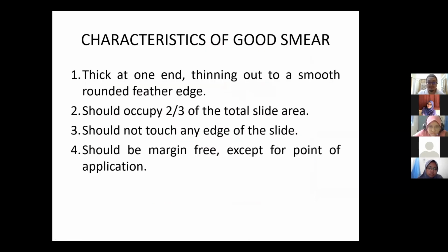Characteristic of a good smear: thick at one end, thinning out to a smooth, rounded, feathered edge. We don't want stairs. Many people will have them, because they are shaky and not confident the first time. They put the drop of blood, put the smear, and when they pull, like an unskilled pilot, they stop and go up again. So there are stairs. You will see those stairs. Don't smile, Nurul Ain. We want to see yours.